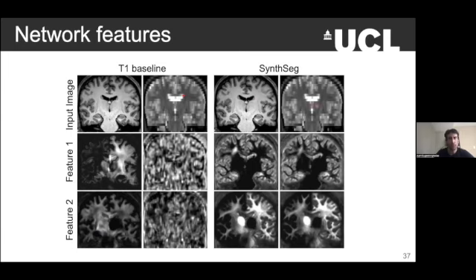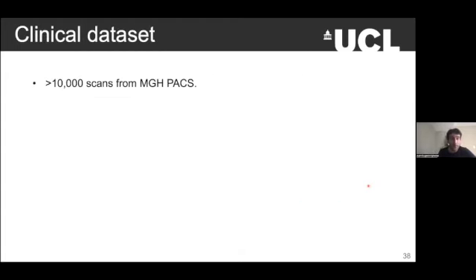But with SynthSeg, when you take these two images from the same subject, right? One is T1, the other one is a downsampled T2, and you push them through a network. The features look almost the same, which is, I mean, it's a bit smoother here if you pay attention in the cortex, but for the most part, it is pretty close. And the fun part, what did we do?